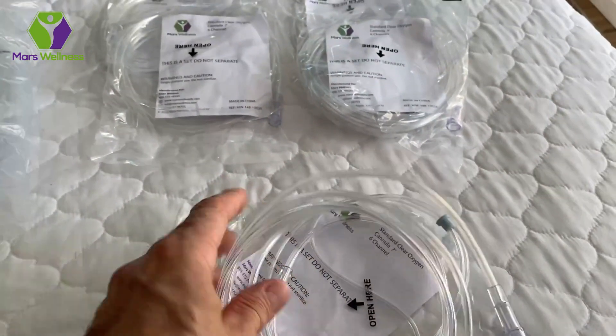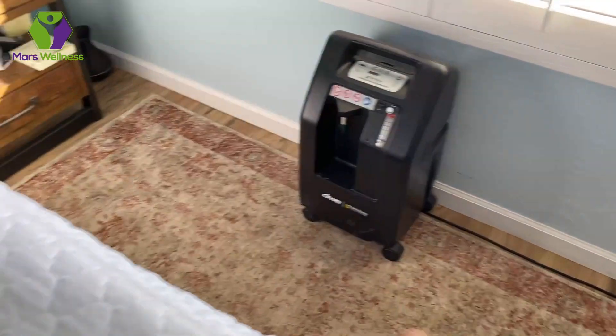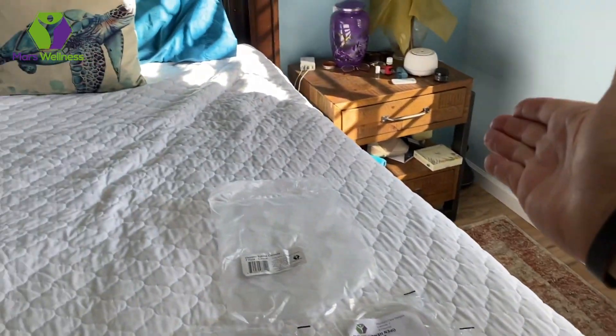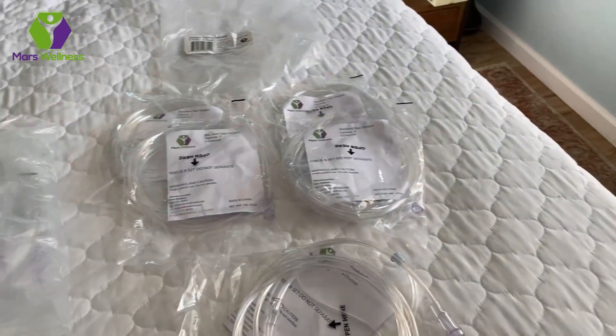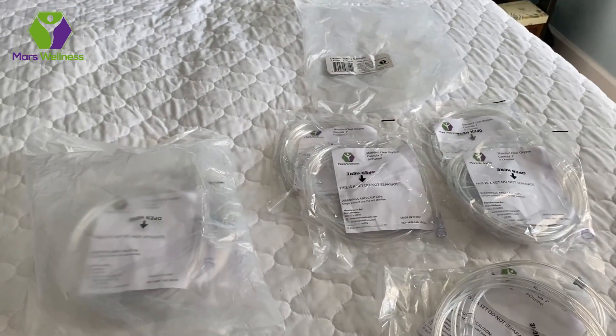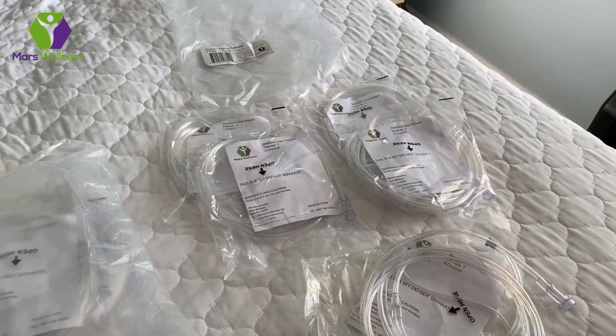What is nice about this is it's 7 feet. Our oxygen concentrator is over on the side of the bed, and in order to get it across the bed, 7 feet works great. We don't have to have the oxygen concentrator right on the side of the bed — we can put it across and it makes it all the way. That gives you flexibility, so you can have more mobility and move around as needed, not just be tied to wherever the stationary place is.